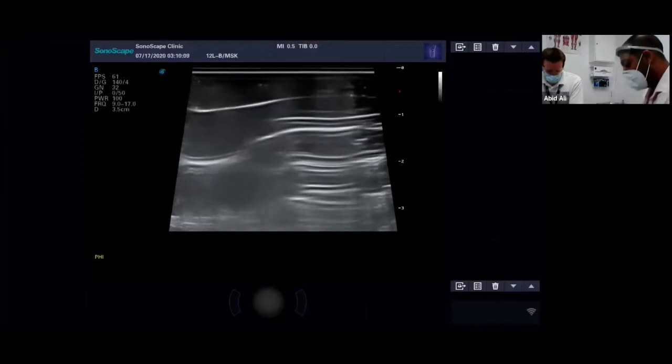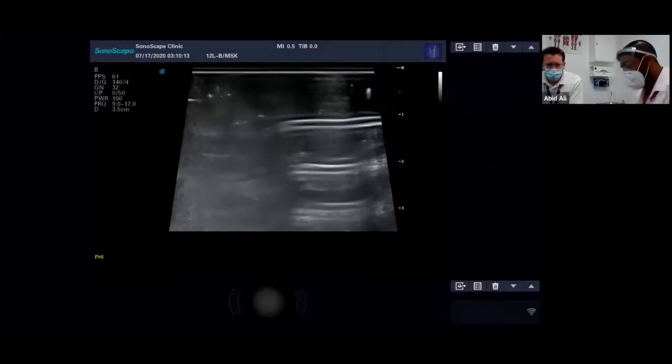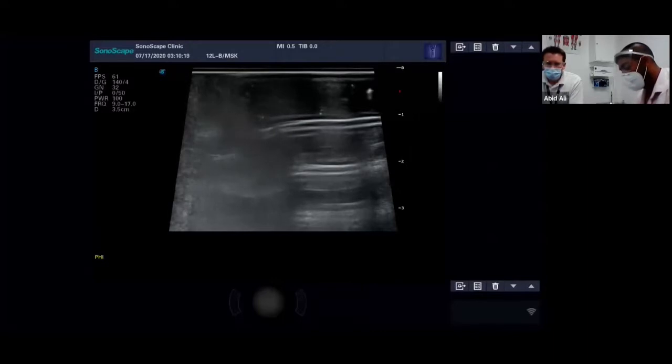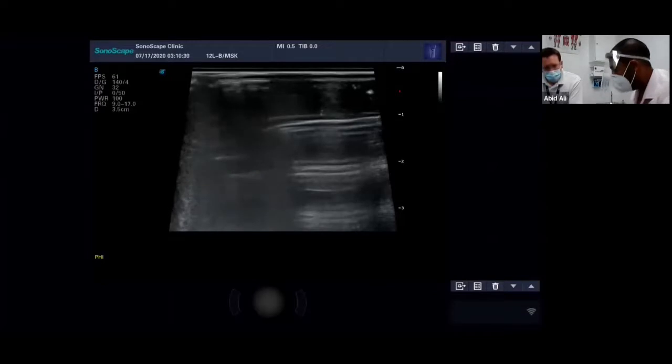So of course, remember in your anatomy, you've got your extensor, you've got your tibialis anterior over here, extensor hallucis, and then you've got your extensor complex here of the digitorum. And then you've got your deep ankle mortise, which we'll be looking at. And possibly we might even need to touch on the talar navicular joint a little bit, because I personally think if you're going to examine the ankle, you should look as far as the talar navicular joint.